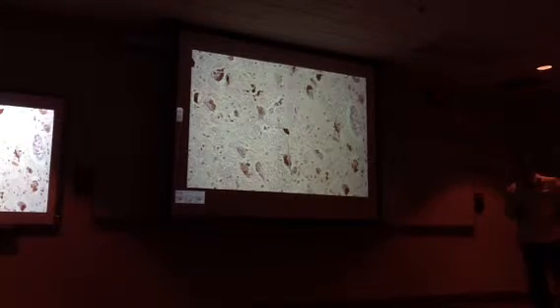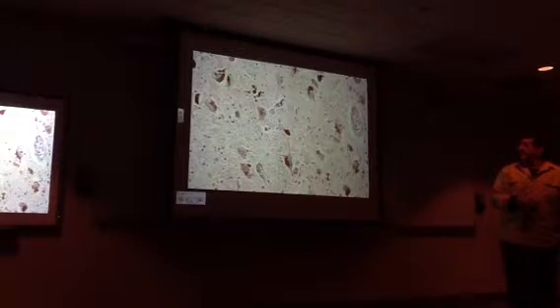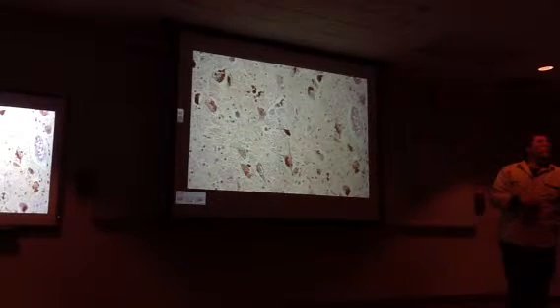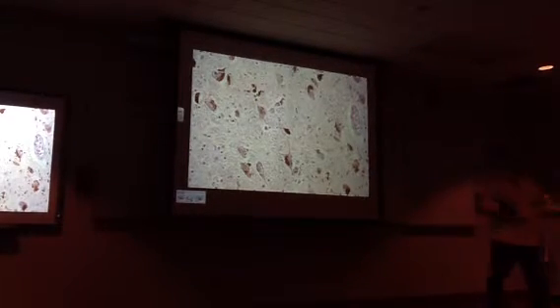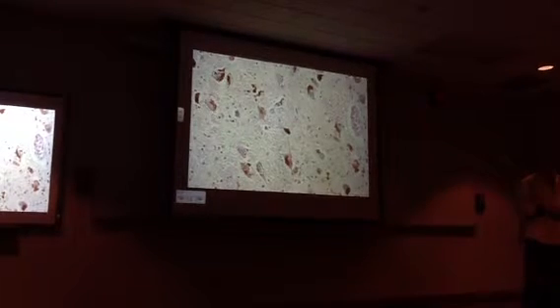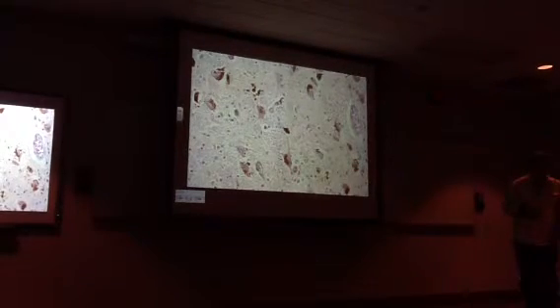Sometimes you'll see in the lab write-ups, look for residual bodies or lipofuscin granules in neurons. Those are very difficult to see, and I would never ask you to ID them. Even on the University of Iowa site, they label them and you still can't see them. So don't worry about trying to identify lipofuscin granules in any of the tissues. Just understand what they are. They're just end products of lysosomal digestion.